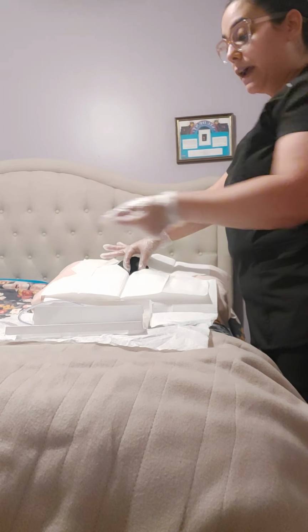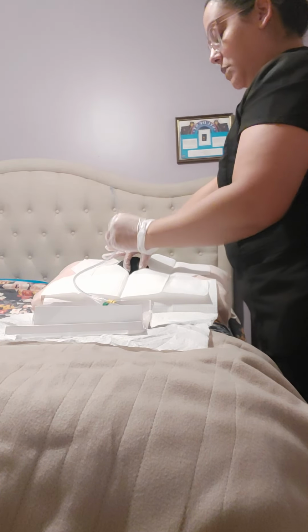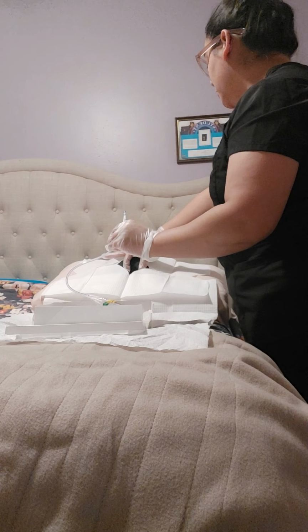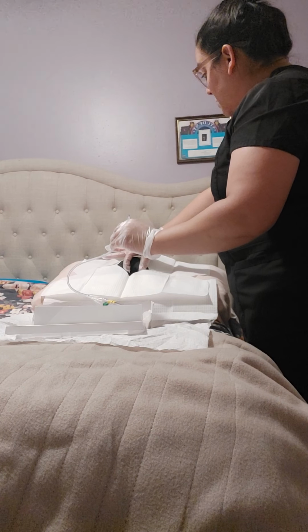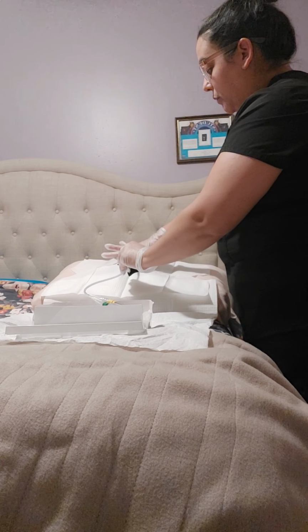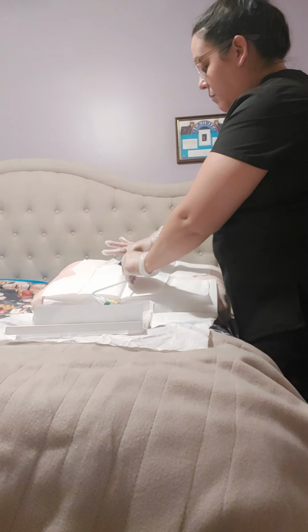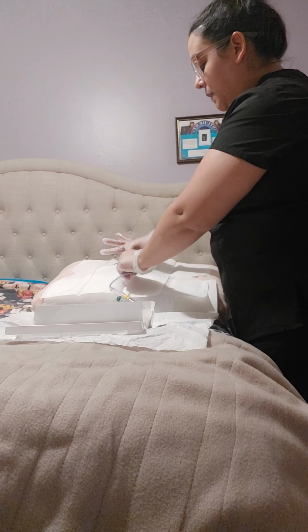Then once I have done that, I would grab my catheter, which is already lubricated, and I would inform my patient. I'm going to insert the catheter now. I'm going to have you take a deep breath and try and blow out slowly. That'll help it be less uncomfortable for you, okay? I'm going to count down for you, okay? So at the count of 3, 1, 2, 3, I would begin to insert the Foley catheter into my patient. I am not meeting any resistance, so I continue to put my Foley catheter in.